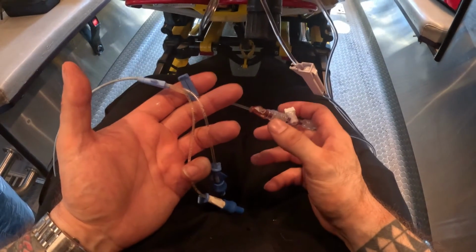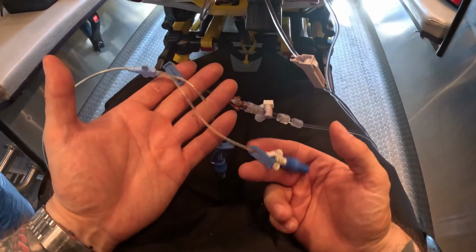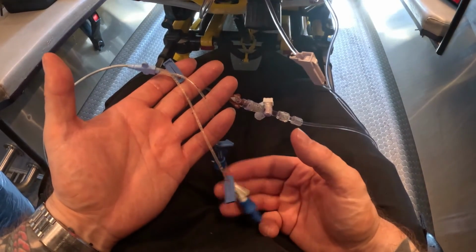You got right distal 16 gauge, your pressors. Medial sedation, and this is our proximal 18 gauge. You're running any push dose medicines that you're going to employ. This is how I would set up my drugs.